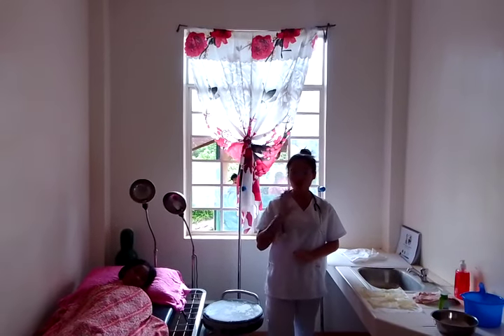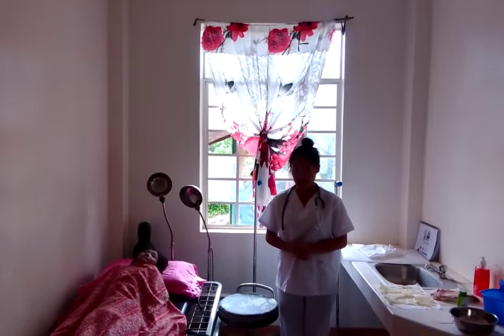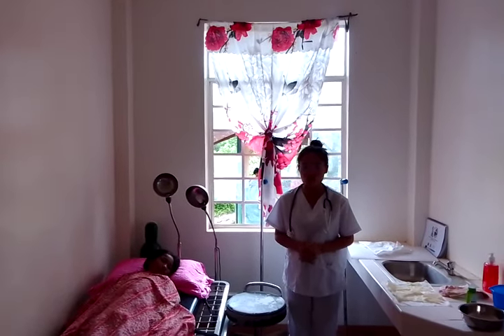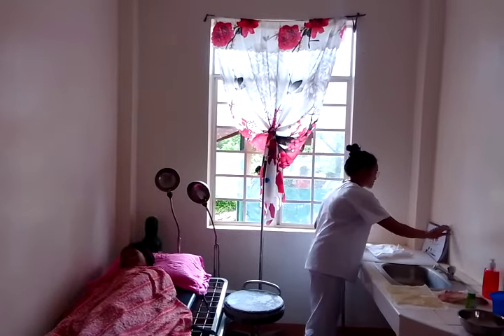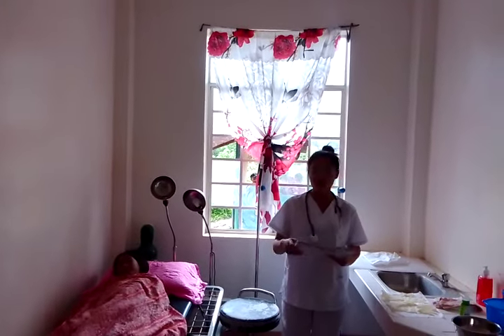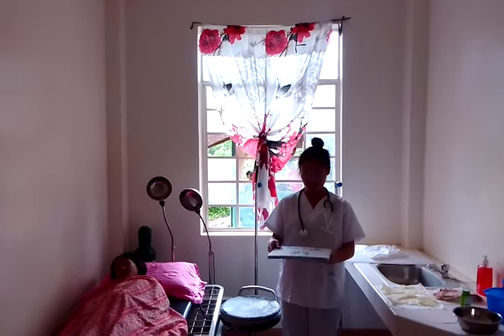Before anything else, we need to follow some checklists. The first thing that we need to do is check the doctor's order. I have here the doctor's order, since we cannot proceed on any procedures if we don't have a doctor's order.